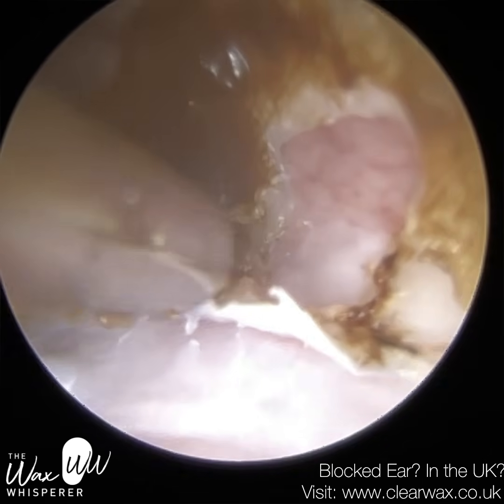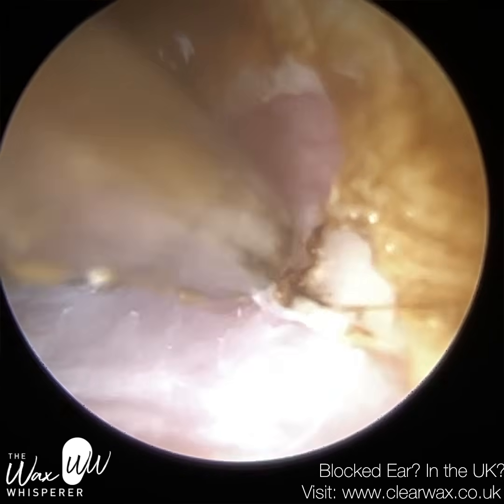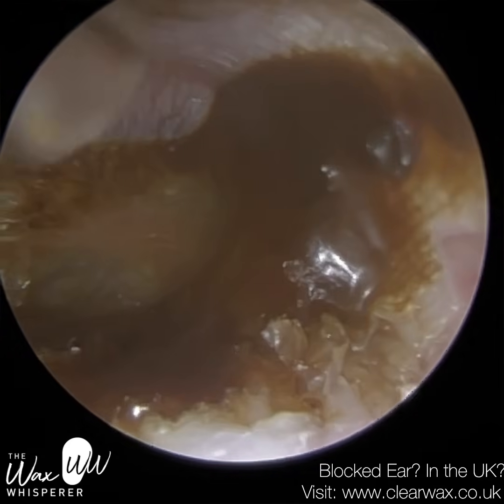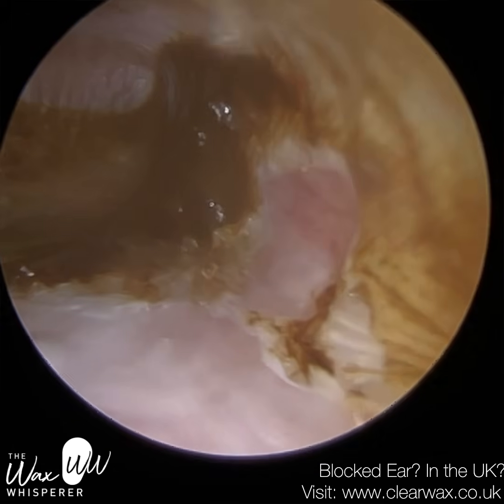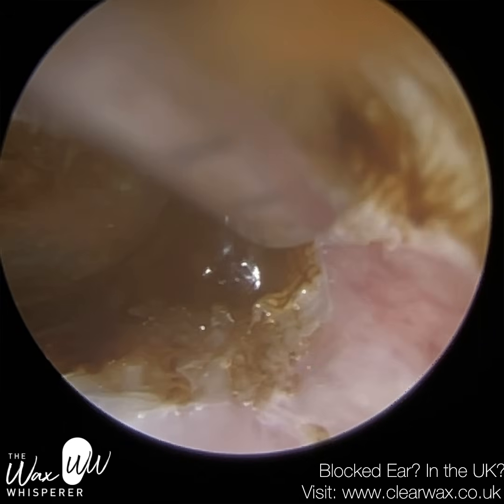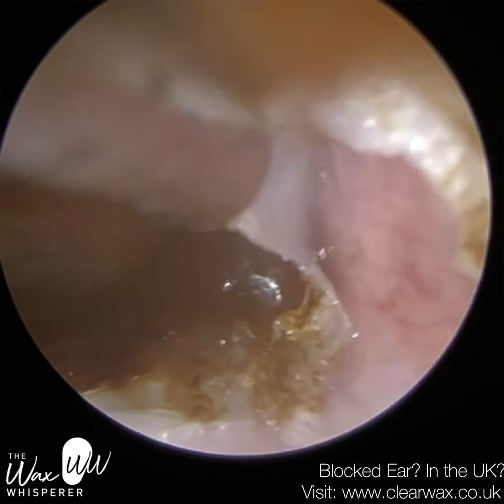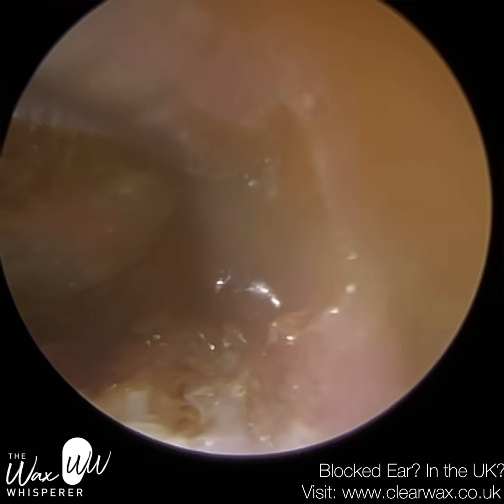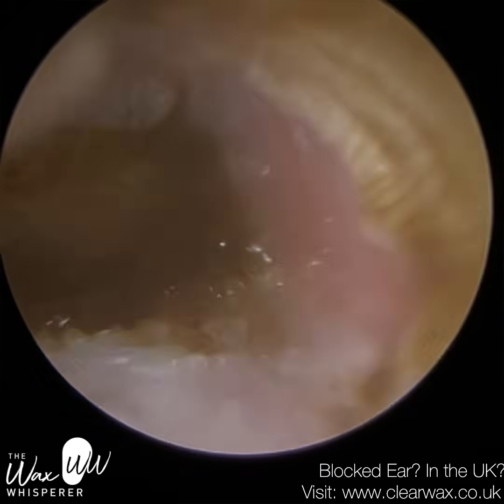So I'm using the fine end suction probe, and I'm just gently peeling away. This ear canal is almost lined in layers of dead skin, similar to an onion. And you can see some of the skin is quite dark, it's oxidized. So that's the surface skin, which is older layers of dead skin. And the innermost layer, which is still somewhat attached to the ear canal, as you can see as I'm lifting it, it's still white. So that's freshly dead skin.